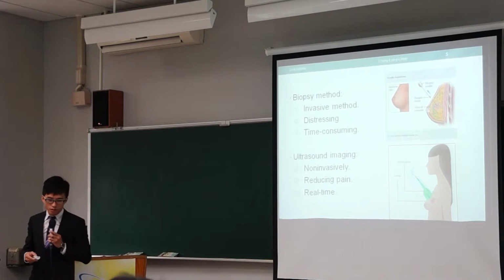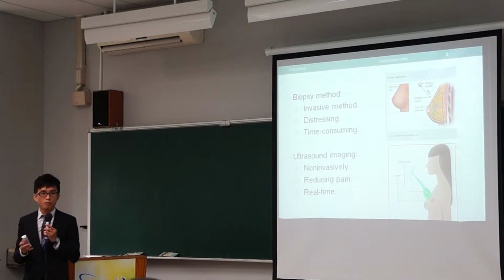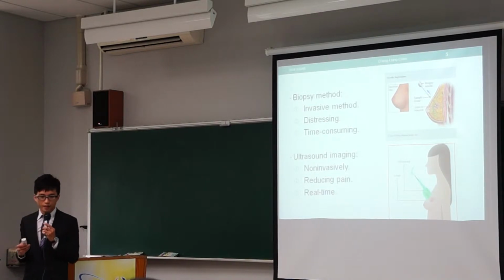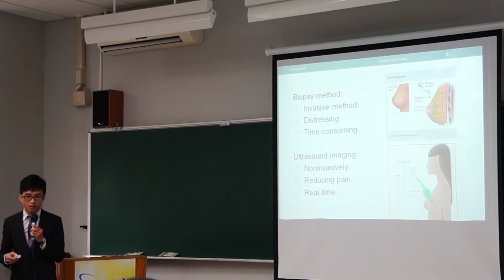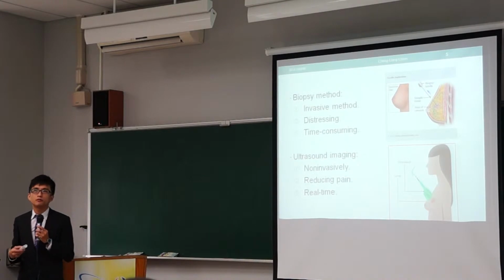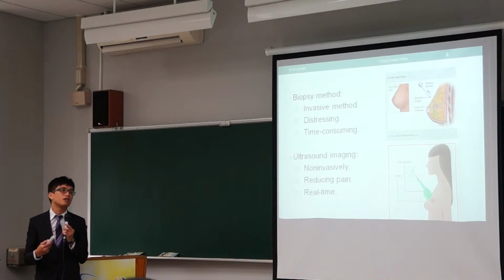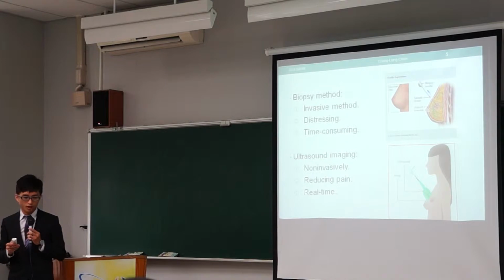But ultrasound imaging has many advantages. It is non-invasive and real-time. In fact, most patients can continue a normal life with early treatment. So, if we can provide information about tumor grade immediately, the doctor can plan the treatment earlier.